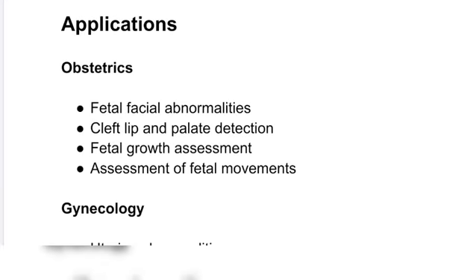Next are the applications. Where do we apply this ultrasound? Mostly in obstetrics and gynecology. In obstetrics, we use it for fetal facial abnormalities, cleft lip and palate detection, fetal growth assessment, and assessment of fetal movement.